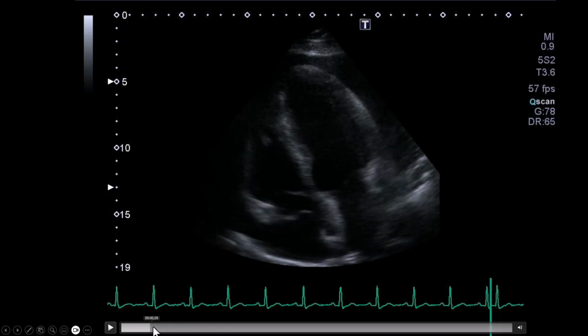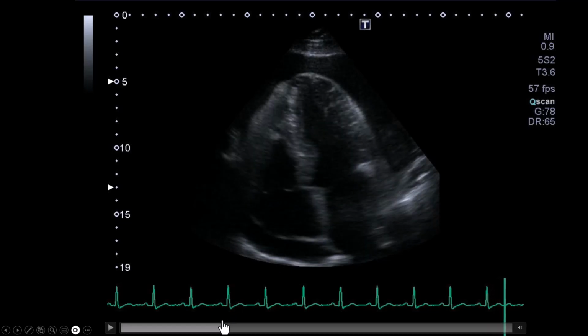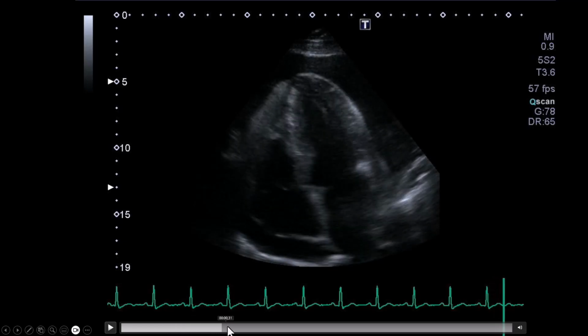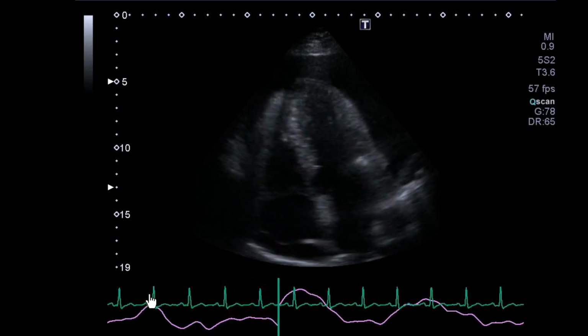You can see here how the effusion causes the wall to bulge inwards. And then when the systole is almost over, the right atrial wall expands downwards again. So in ventricular systole, or in other words, in the diastole of the atrium, only half of the atrium or something around that is actually available, if at all, to fill. So here there is clearly a compromise of the inflow into the right atrium. That means that it is already beginning to be hemodynamically relevant.